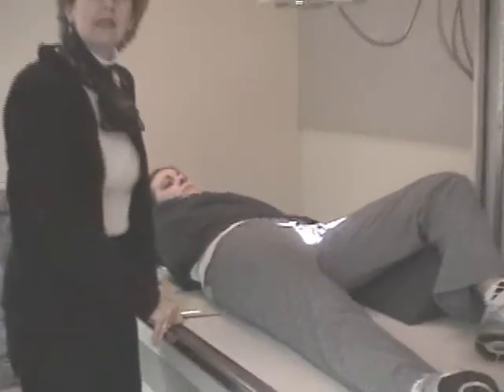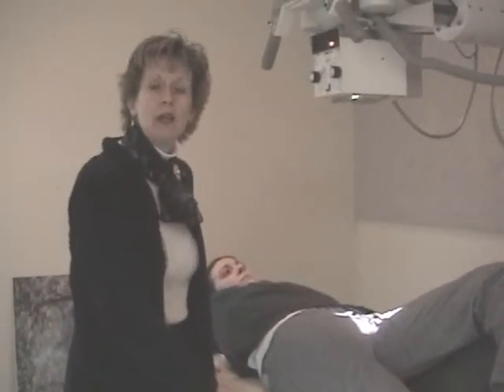And without even palpating the body, I'm just moving the tabletop now without even feeling any landmarks, and I look to get that hip centered. Okay? That would be your frog leg. Okay, that is one lateral option. We're going to shut the camera off for a minute to get set up for the cross table lateral, and we will be back.